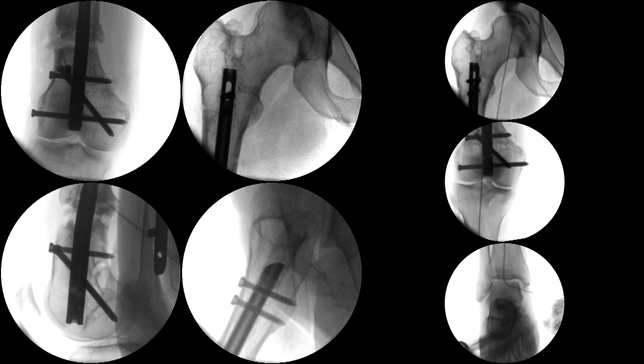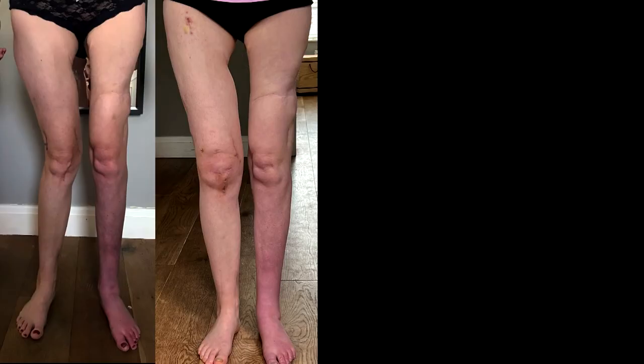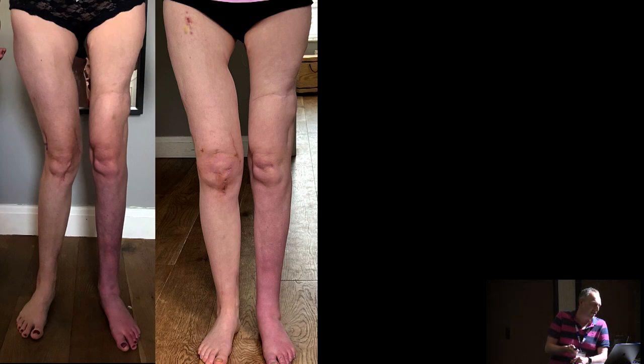And again, as we've said, we've checked that fixation. It's maybe slightly lateralized from the actual mechanical axis, but we were fairly happy with that. We'll just come on to the post-operative. So these are the photographs. She actually sent me these because it's a relatively recent procedure.